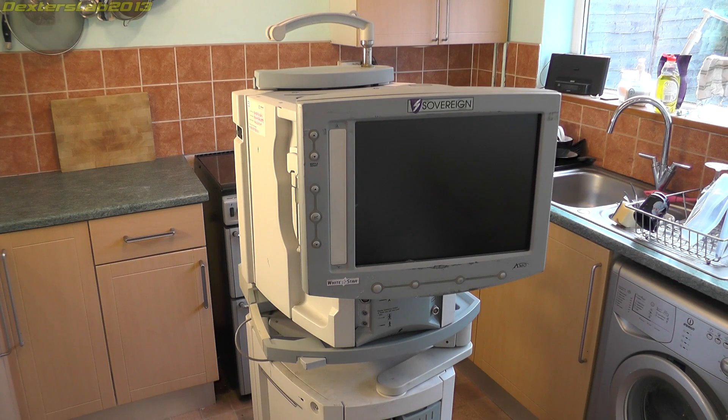Hey everybody, welcome to another Teardown. Today we have this rather large machine here that I've got down in the kitchen. This is an AEMO Sovereign White Star FACO machine. FACO machines are essentially a device which has an ultrasonic needle which allows you to perform cataract operations.